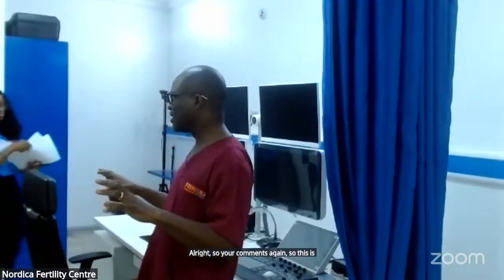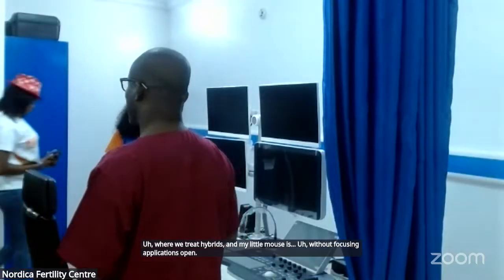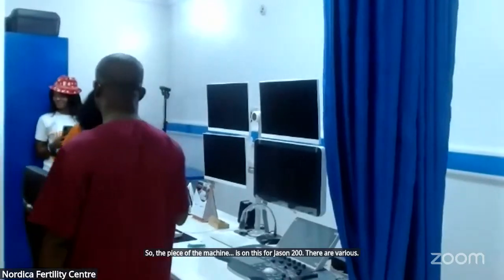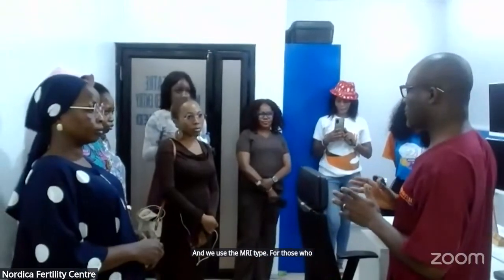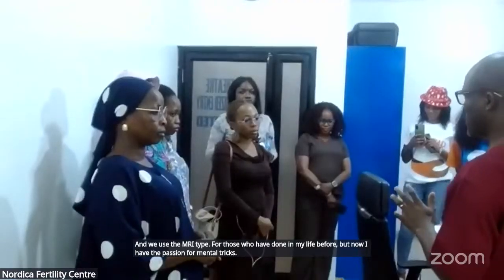All right, so you are welcome once again. So this is our theater, where we treat fibroids and adenomyosis without cutting our patients open. So this is the machine. This one is called JC200. There are various types. Now, high intensity focused ultrasound, this type is the ultrasound type. Then there is the MRI type. Those who have done MRI before, those normal MRI, but now has the HIFU component of it and is also used to treat the fibroids as well.